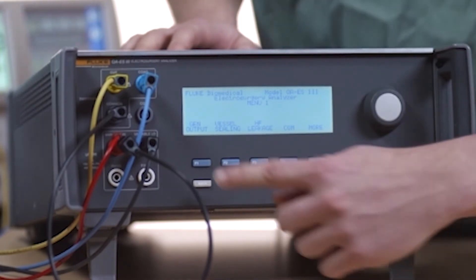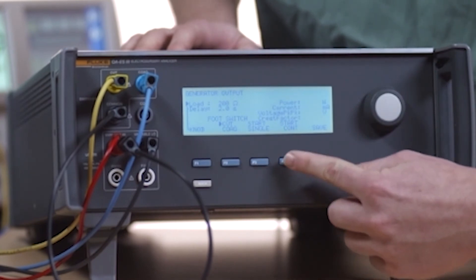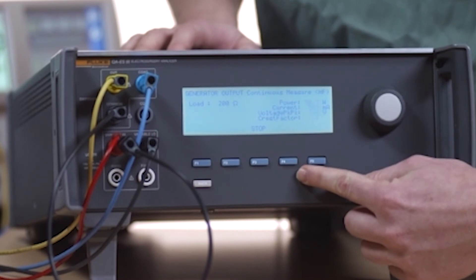In generator output tests, the continuous measurement mode of the QAES3 activates the footswitch relays to turn on the ESU being tested.